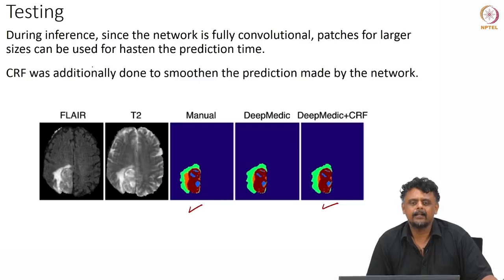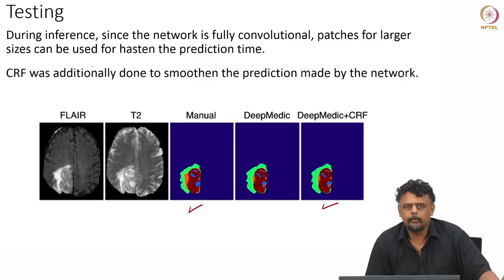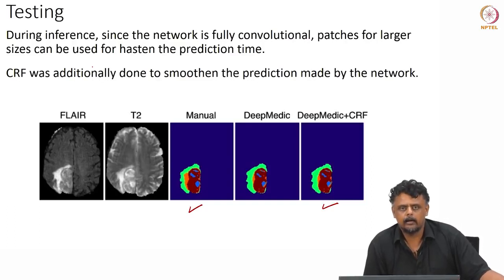So, for instance, the non-enhancing tumor or the necrotic core comprises a very small number of pixels corresponding to the tumor itself. Now, if you consider the tumor itself, it occupies a very small volume in the entire brain. So, less than 5%, I am being very conservative, less than 5% of the brain actually corresponds to the tumor. Okay. So, that is the class imbalance.